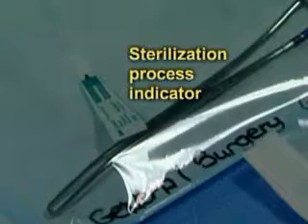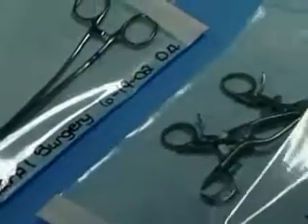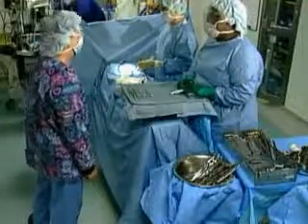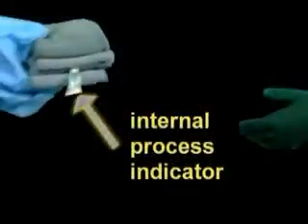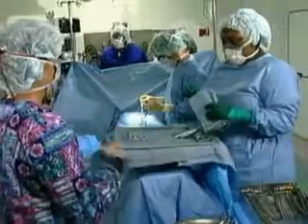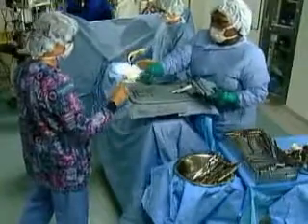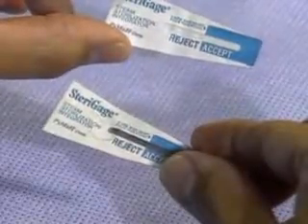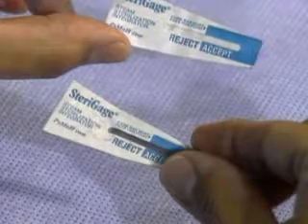A sterilization process indicator should be placed on the inside of every package that will be sterilized. Either the internal or external process indicator should be clearly visible before the package is opened and placed on the sterile field. The purpose of the external process indicator is to differentiate between processed and non-processed items.